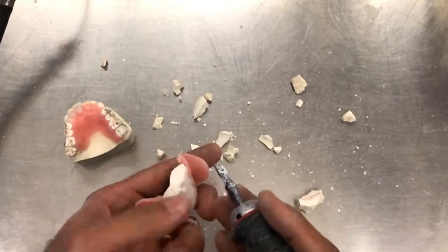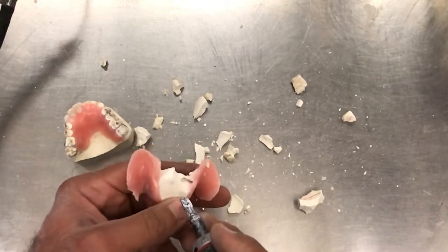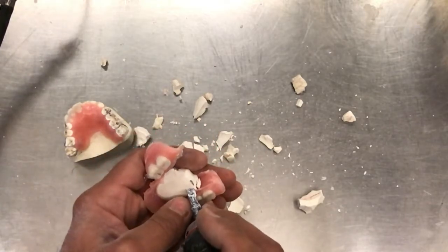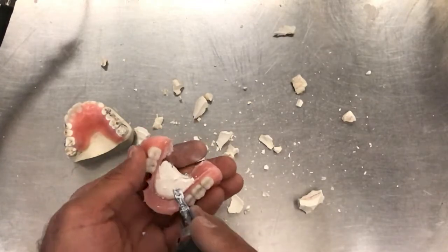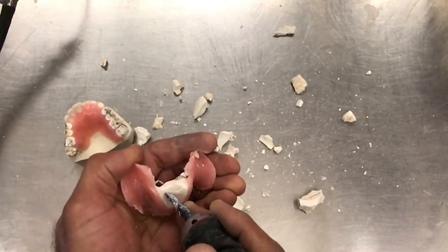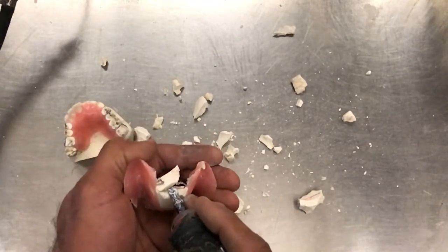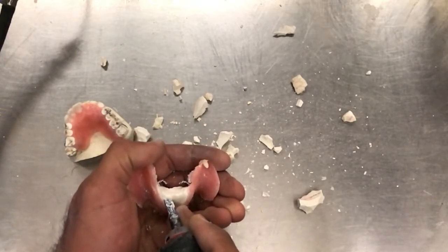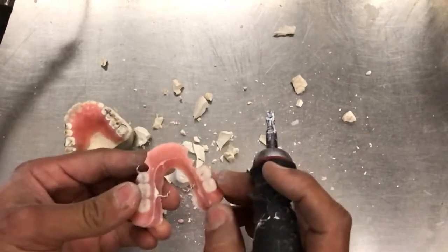I know it's somewhere in here. There's one of them, right there. And the other one is somewhere here. There it is. And that came out rather nicely.